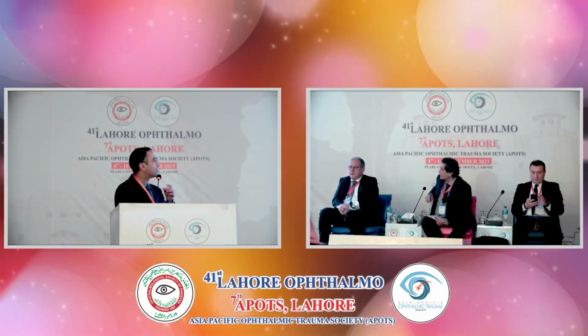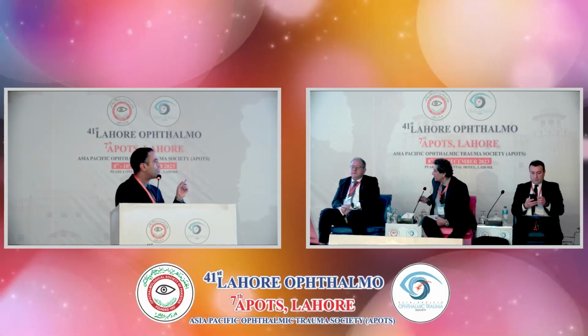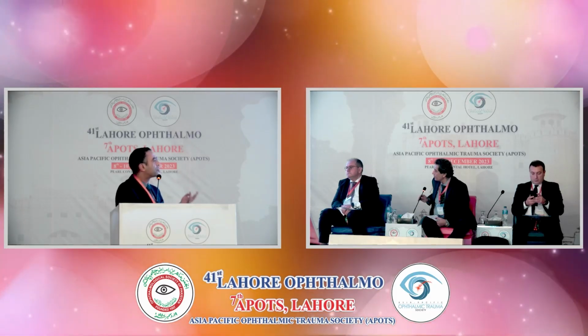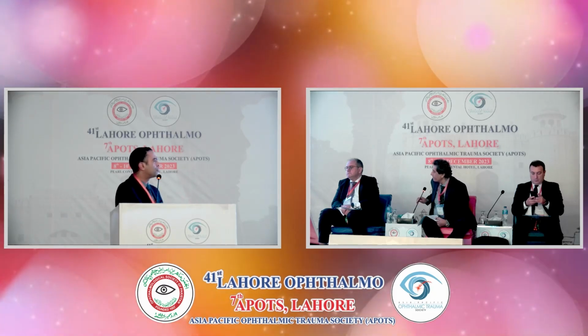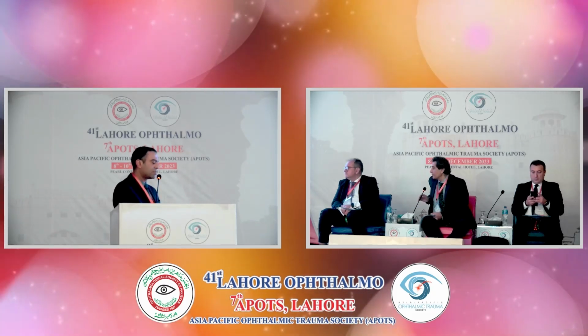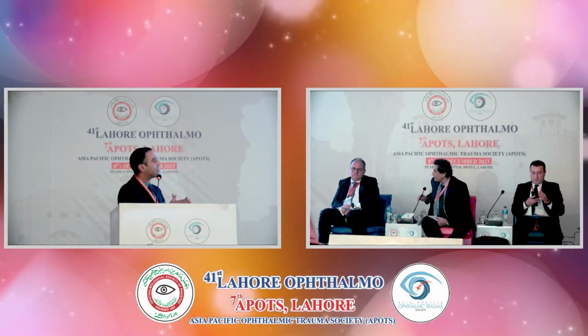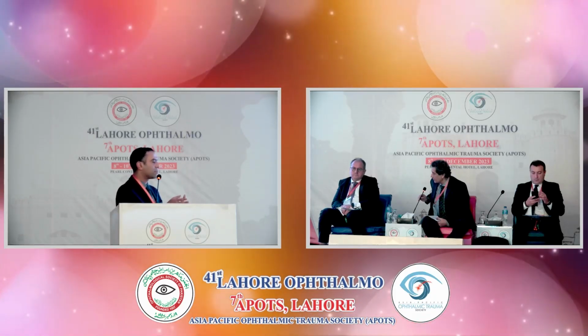This was a 1,700 micron hole. Huge. And I expect that it is iatrogenic. It is a trauma case, vitrectomized before. So of course an ILM flap wouldn't do the thing in this case, because it is very large. I need to fill it with retinal tissue. A very large macular hole, more than 1,000 micron. I have no personal experience with these as well.